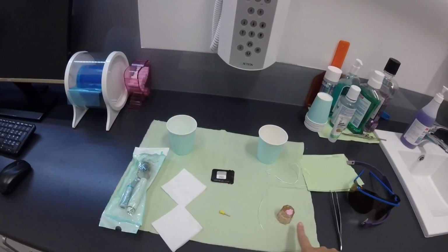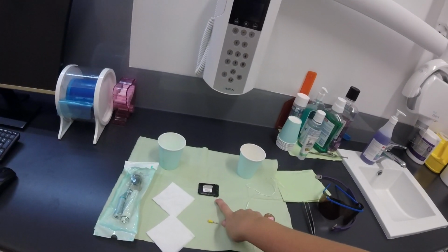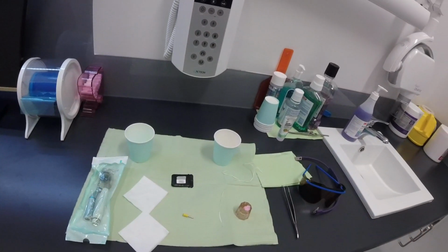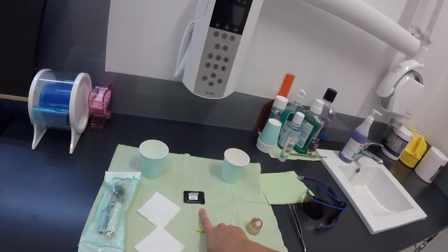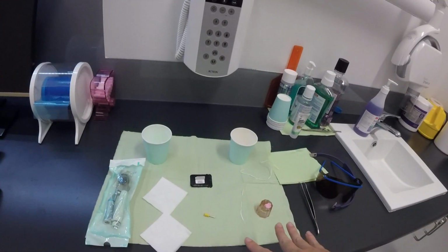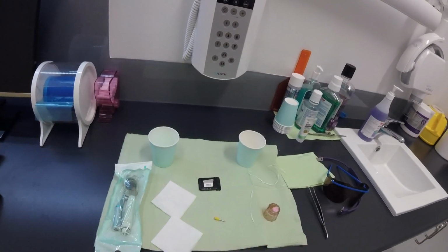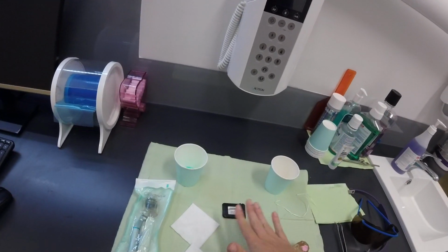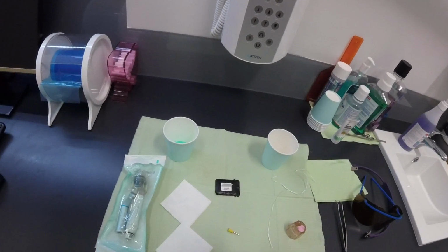So we've got Prophy paste, Prophy wheel, a bite wing. Now the bite wing x-rays also, I should add, are taken routinely every 2 to 3 years, or if the dentist sees something suspicious. So you don't take one every time. It's just dependent on when their last x-rays were taken. Some people don't want them, and that's fine, but always handy to check when your last x-rays were taken, or have your x-rays put out somewhere where they're not going to be in the contaminated zone, and you can grab them if need be. But that's what we've got out today.